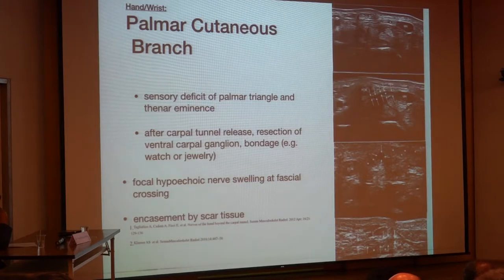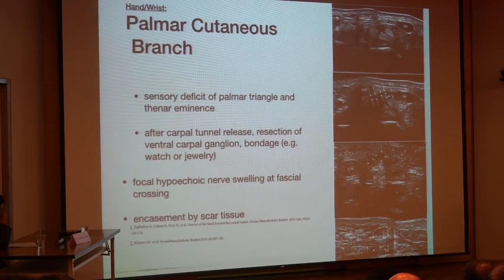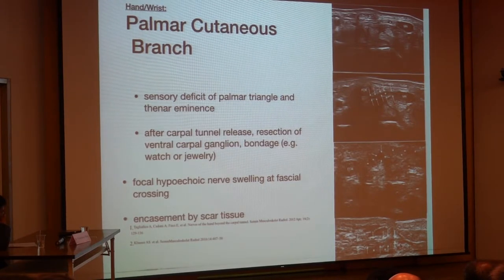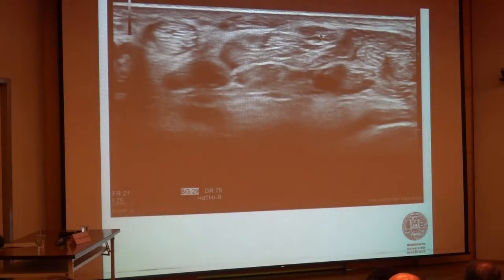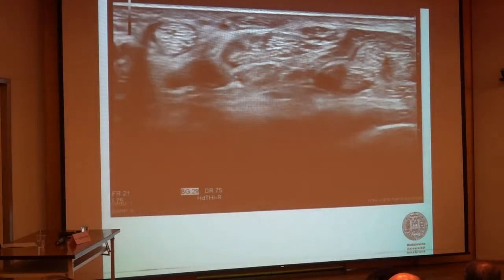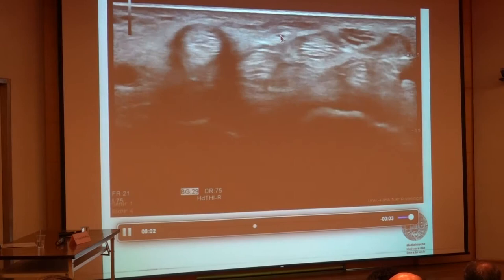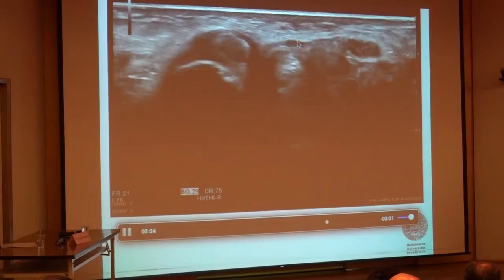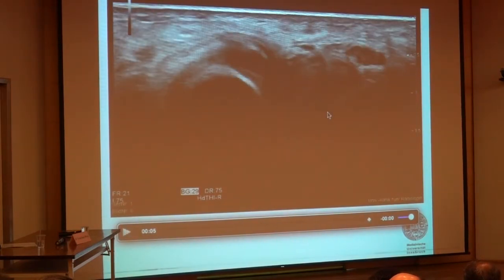There is a lot of scar tissue after CTS surgery around this entrapped, very small nerve. We can see the tiny nerve becoming bigger at the level of the entrapment due to scar tissue, with increased size at the area of the entrapment.